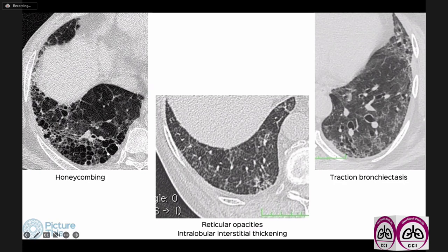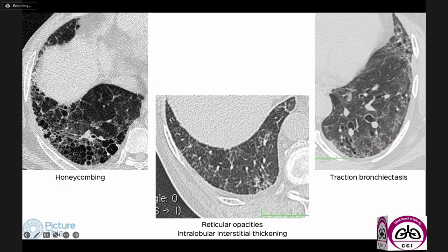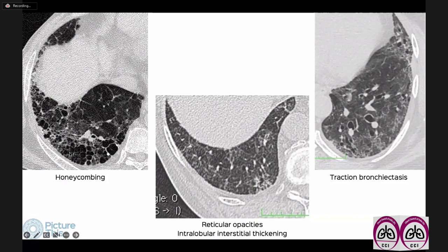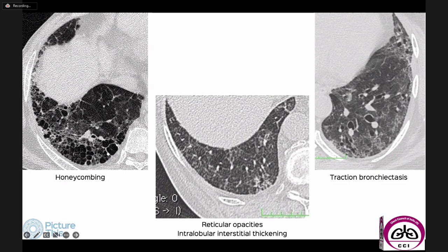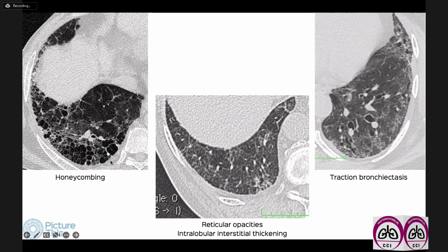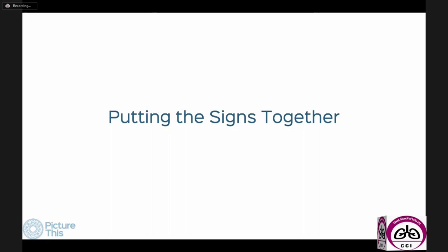Reticular opacities are linear opacities extending up to the pleural surface. Traction bronchiectasis is dilatation of the distal bronchioles along with reticular opacities — this is a defining feature of fibrosing ILD. You may or may not get honeycombing in a fibrosing ILD, but when you get traction bronchiectasis you can confidently make the diagnosis. Honeycombing is the presence of cysts with shared walls starting in the subpleural region and extending towards the hilum — multiple stacked layers — with defined walls, unlike the thin walls of paraseptal emphysema. Honeycombing is specific but not very sensitive for fibrosing ILD.